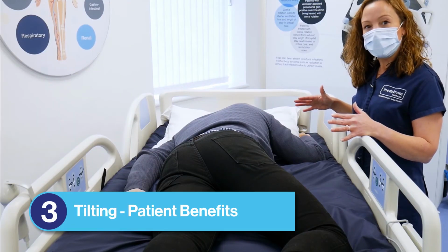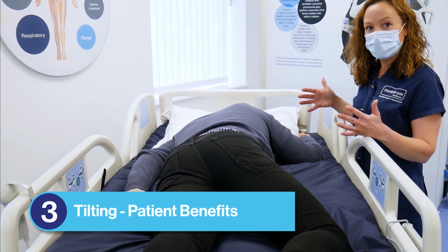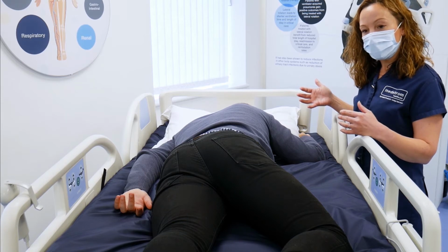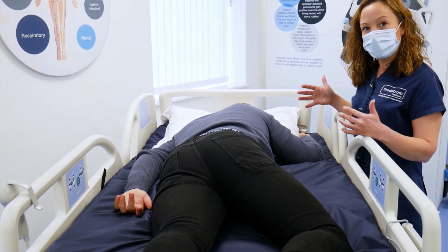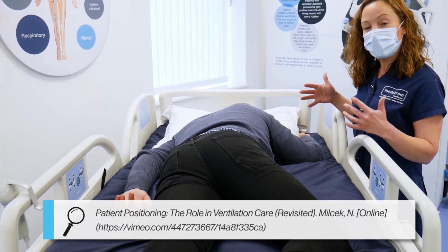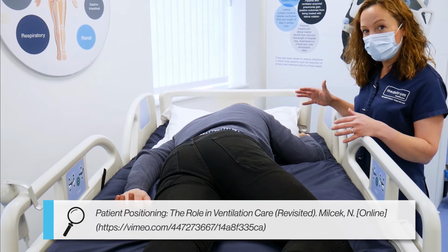Beds such as this one that can offer a lateral tilt may assist with small micro movements in order that different parts of the body may become load bearing. It should be noted that with hemodynamically unstable patients, this decision will be led by the multidisciplinary team, but the benefit of a tilt function will be that the movement will be hands off, so I won't have to physically touch the patient to do so.